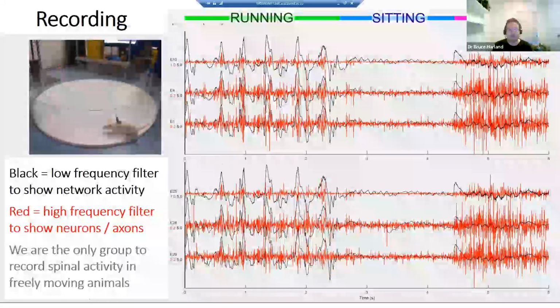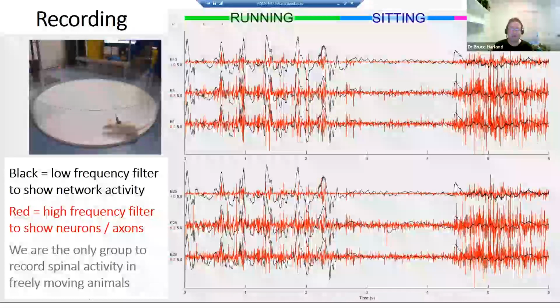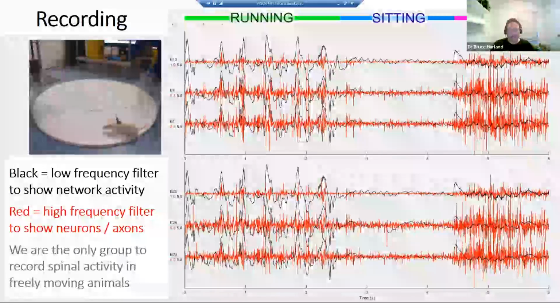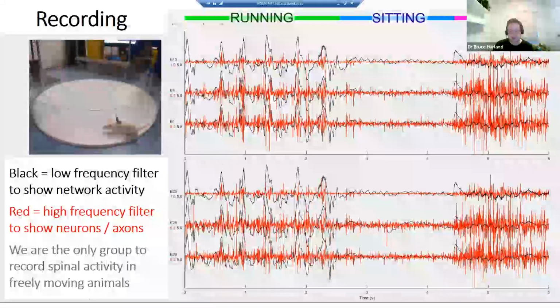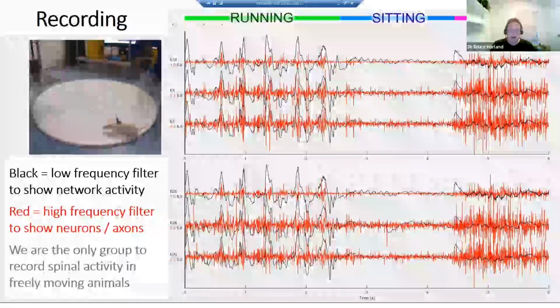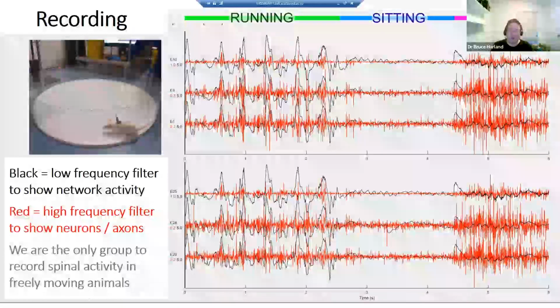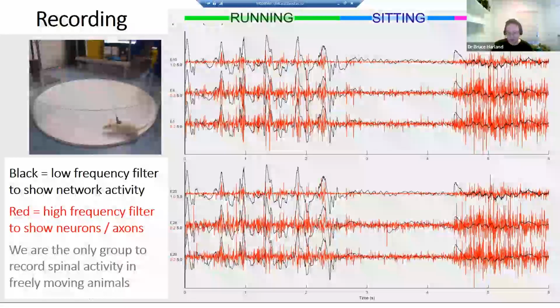And what we can see is when the animal's running, the low frequency activity, the black trace, sort of oscillates up and down like mountain peaks. So this most likely corresponds with the hind leg gait of the animal. Because we have our implant placed on the thoracic spinal cord, we're only recording activity from the back part, from the legs. At the same time, the high frequency spikes seem to be a little bit denser in the peaks of these oscillations. And this is something that you often see in brain activity. The firing of the single neurons corresponds to the network oscillations of the low frequency part of the signal.